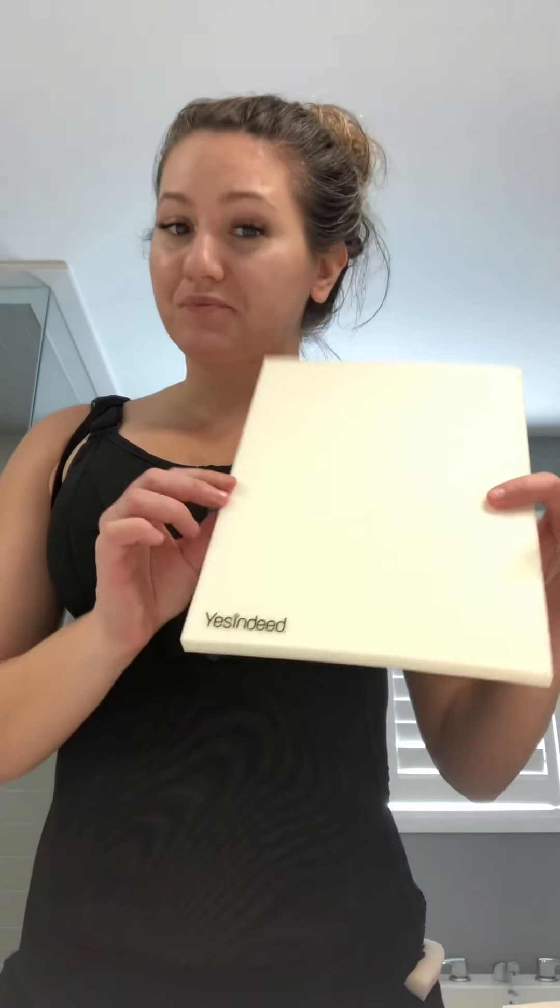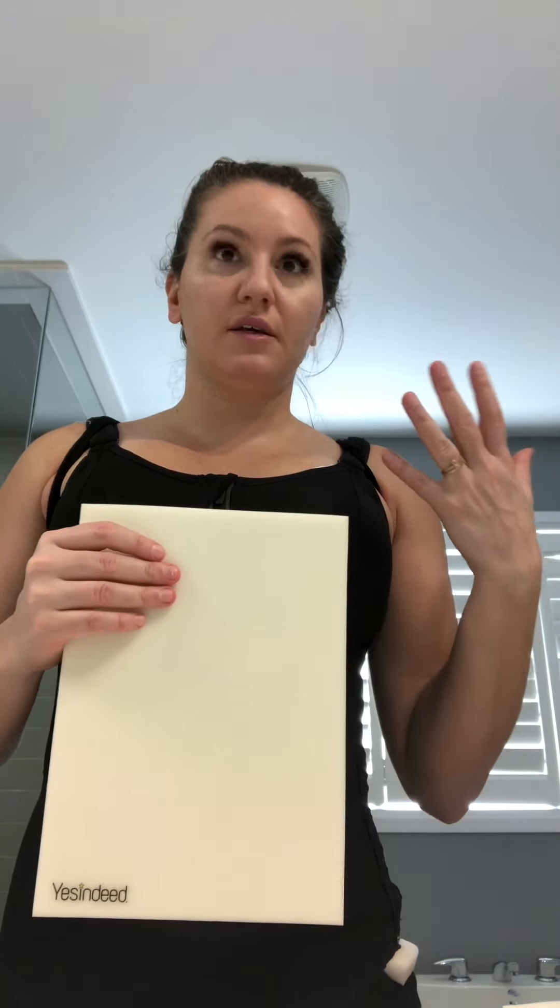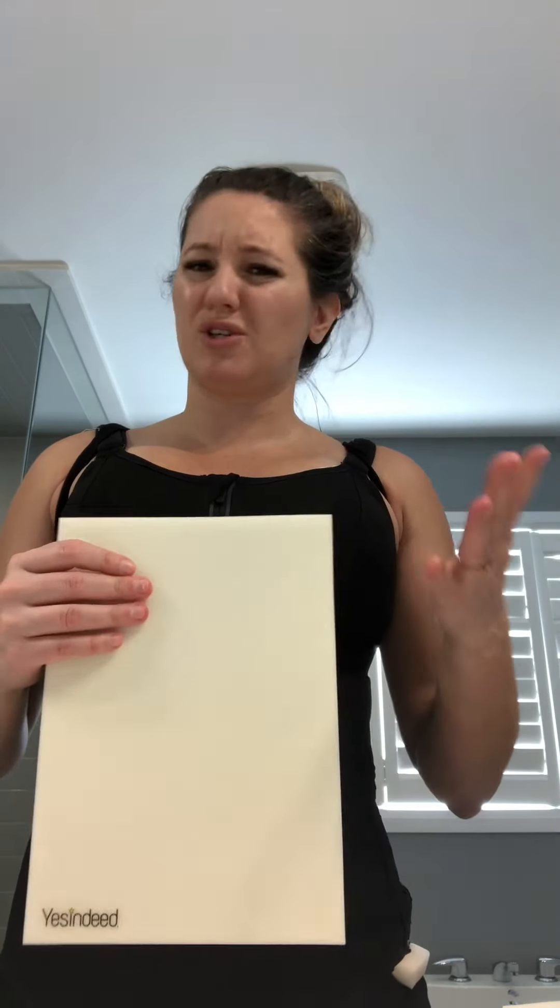Something just came in the mail. This is my liposuction foam. It's not something that my plastic surgeon per se recommended or told me about, but it is something that I have researched and I'd seen used especially a lot in the States. What it does is it basically helps with contouring, it helps with compression, and it helps with providing a barrier between your body and these very, very tight compression garments.